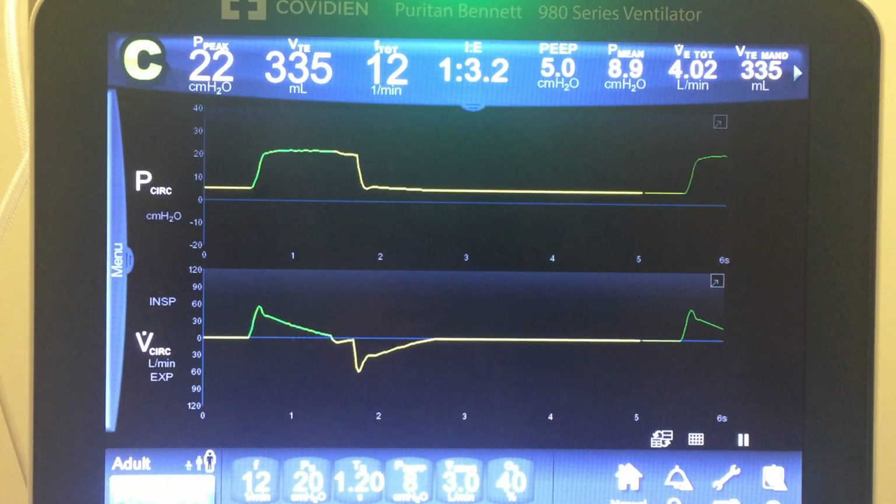Okay, so if you want more on the pressure support, check out my more in-depth video. It'll be really short, just with some better pictures.